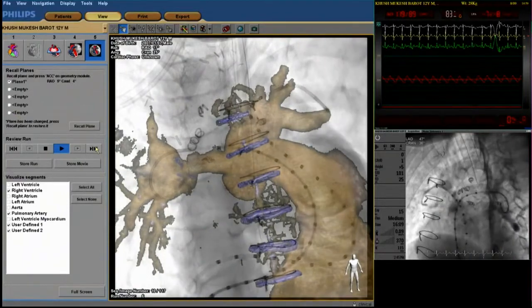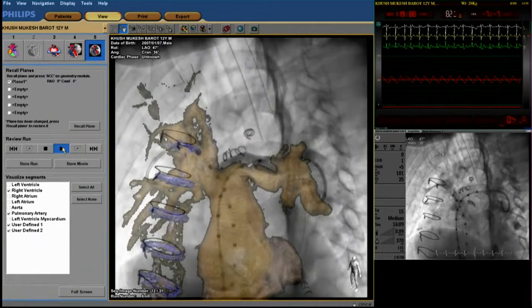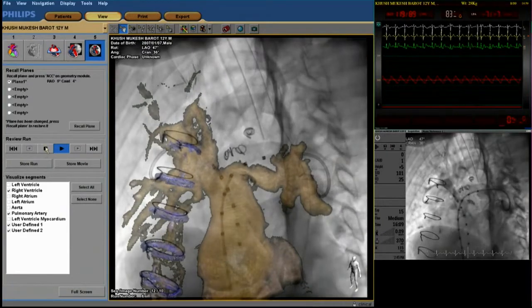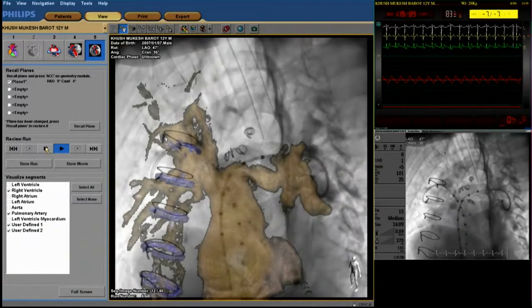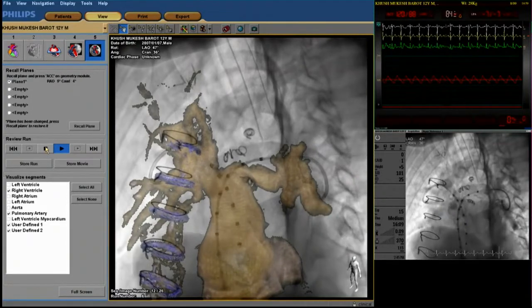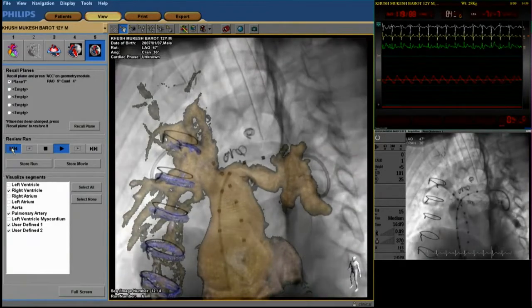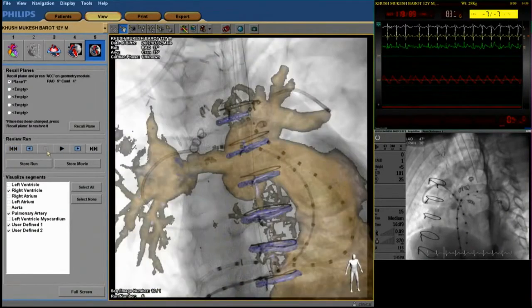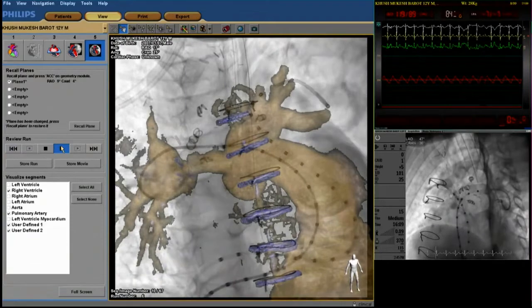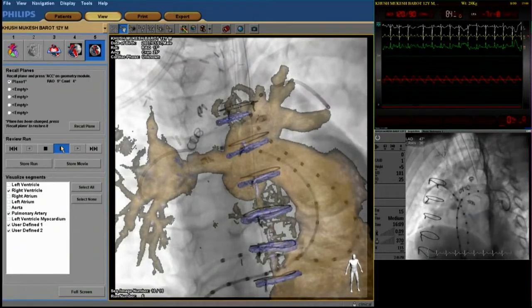Show the LPA overlap. Yeah, run it. So you can appreciate that there is a two-level stenosis. You just match it now. There is an initial ostial stenosis, then a bulged portion, then a second-level stenosis, and then it's branching out. So the total length was 26 to 27 on the left and somewhere around 27 to 28 on the right. So question number one was the compliance of the lesion, and question number two is the type of stent: is it a pre-mounted formula stent, which will have a little lower radial strength compared to a regular stent like an Andra or a CP?